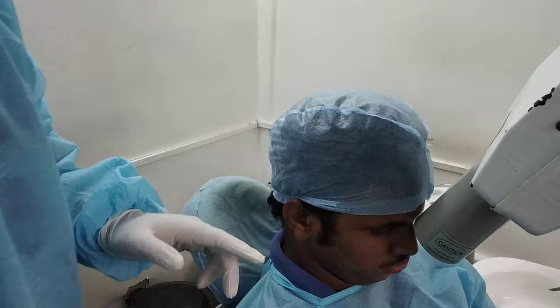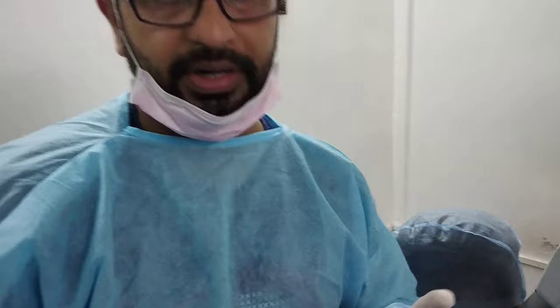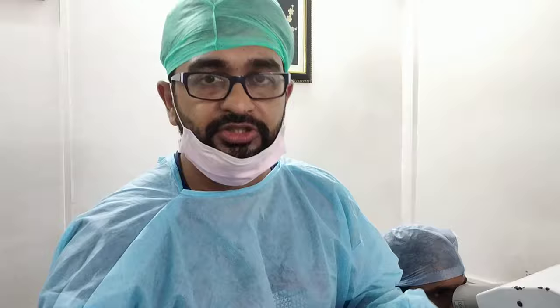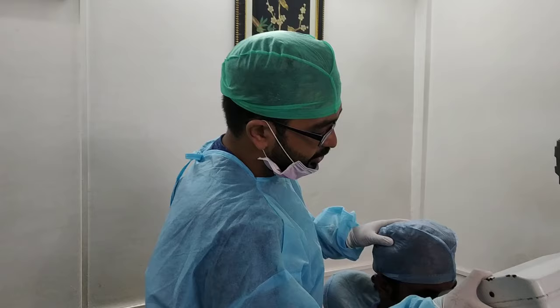If the vertical angulation is too high — suppose you are doing the x-ray at too steep an angle — then whenever you are doing RCT of the patient, the tooth will come foreshortened. But if the angle is too low, there will be elongation of the tooth. So you have to give the proper angulation and proper head position, which is where we often make mistakes. This is the correct head position for the upper anterior tooth.